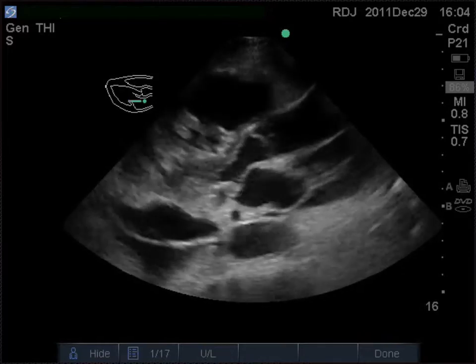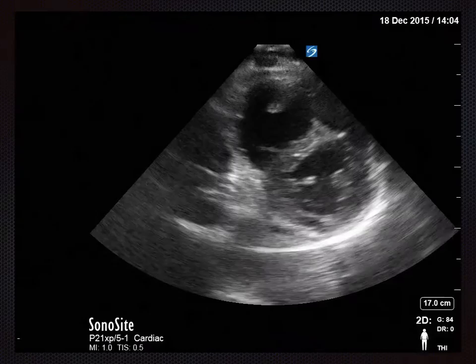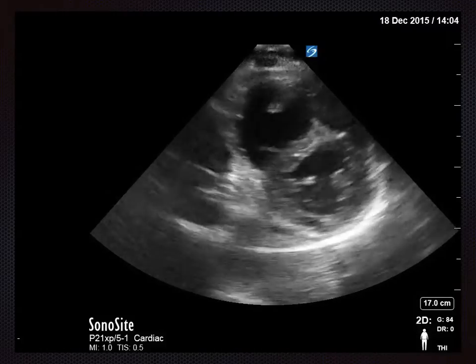So remember, pericardial fluid above and to the left, pleural fluid below and to the left. Now, if we cut round into our short axis views, you can often see fluid around there too. So you can see just around certainly the posterior and inferior part of the heart while it's beating, there is a little black rim around there, and this is a small pericardial effusion.